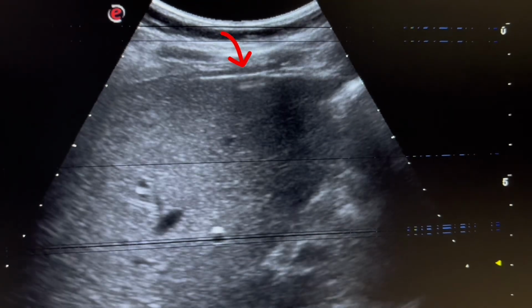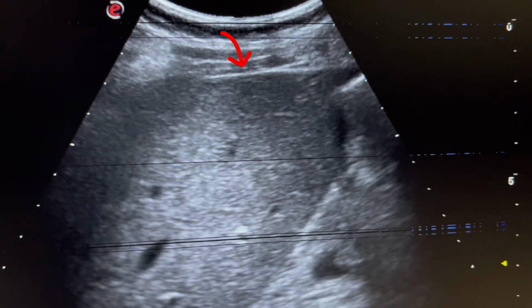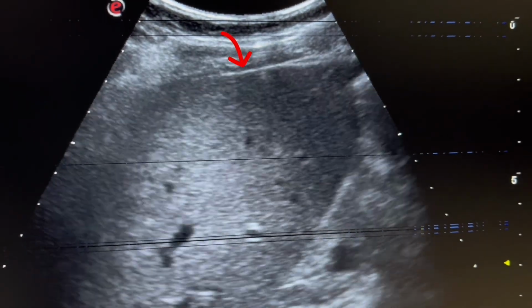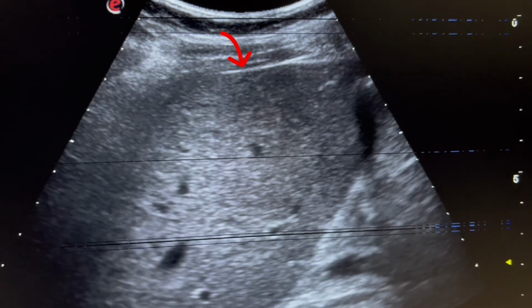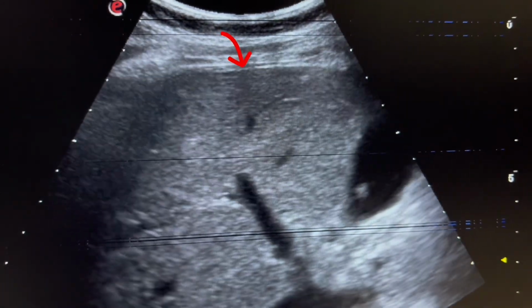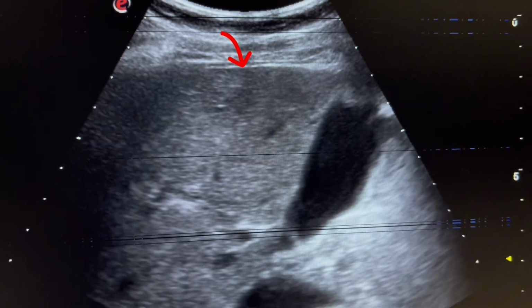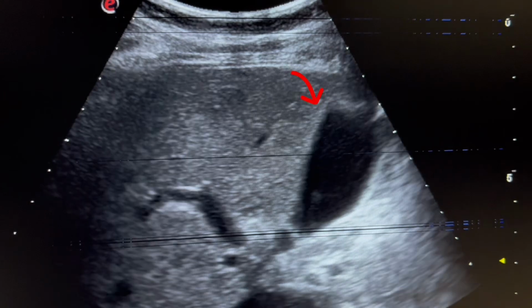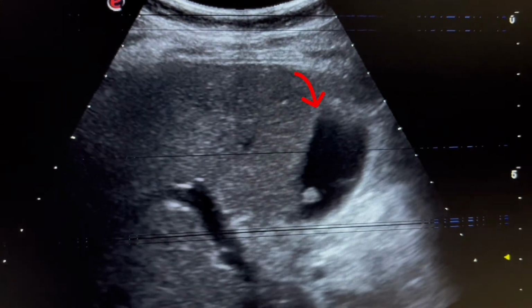Now scanning the right upper part of the abdomen, and the patient is lying in supine position. Here we see the left lobe of liver, which is normal and shows normal texture. This is the gallbladder, which contains anechoic fluid.